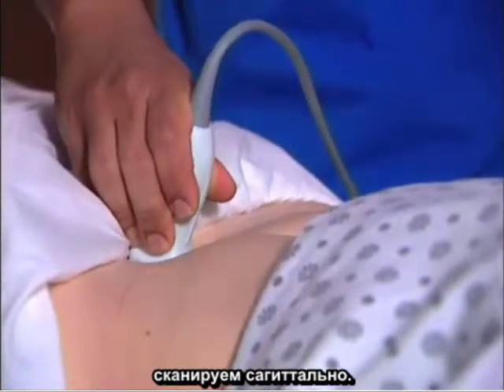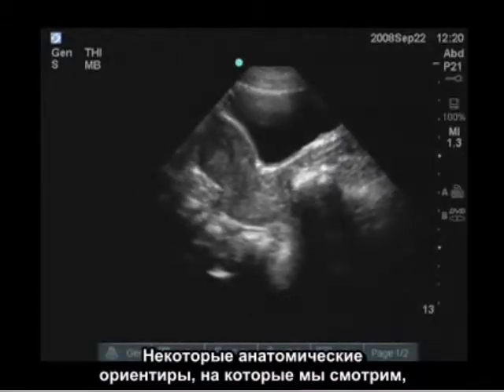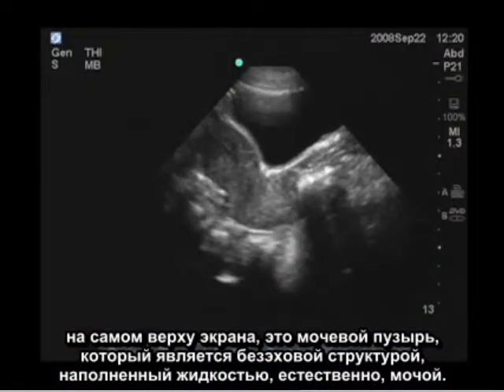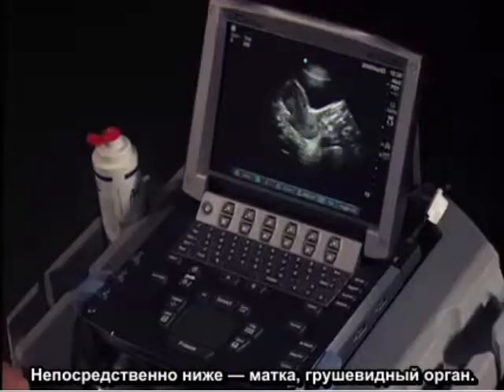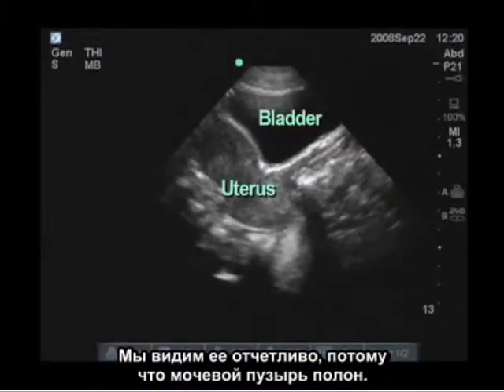So we're scanning now here sagittally, and some of the anatomic landmarks that we're looking at: the very top of the screen is the bladder, which is an anechoic structure, fluid filled obviously with urine. It's got nice walls around it. Just below that is the uterus, which is a pear-shaped organ. You can see it well visualized because the bladder is full.